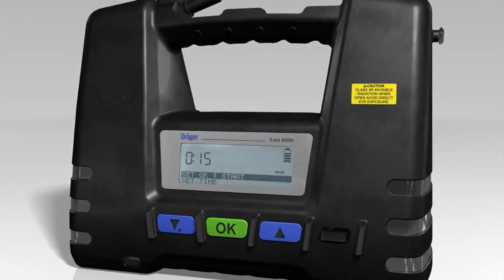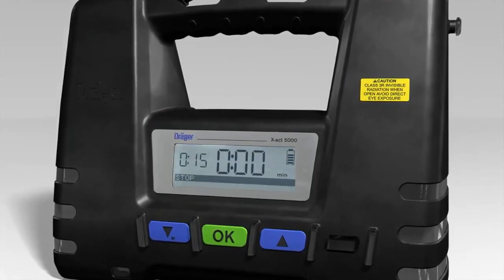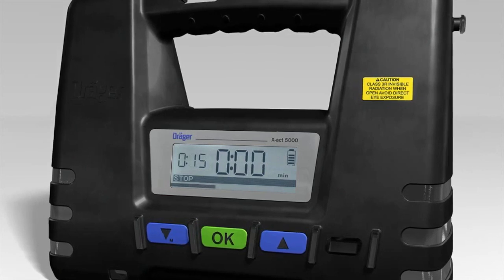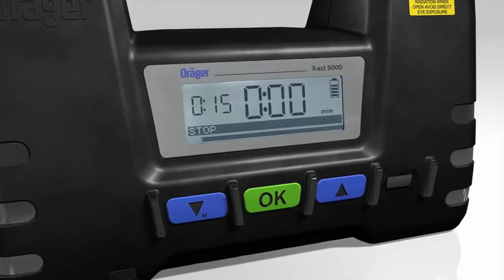The message 'Set OK and Start' now appears in the matrix display. Press the OK button to instruct the Dräger X-Act 5000 to start sampling. During the sampling, the measuring time which has elapsed and the volume of air pumped so far are shown in the display.